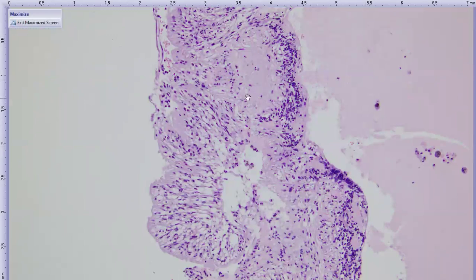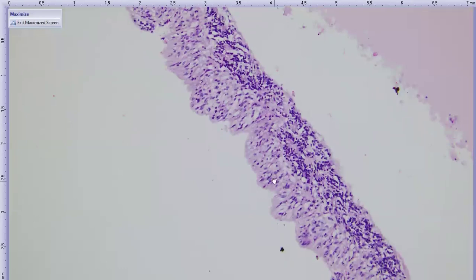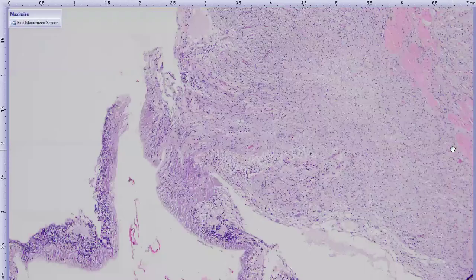But what I thought was interesting is that there's also atrophy and jumbling of the inner layers too. Maybe better to see here where it's a bit more of a flat mount. So we don't really have any retinal ganglion cells and probably not really much of an inner nuclear layer to speak of. Which is interesting to me and suggests that maybe there was some degree of glaucoma in this horse, maybe preceding the retinal detachment at the site. And I blame it on synechia and things like that in the anterior segment. So a lot of extra things for this horse, some bonuses, I guess you could say, in terms of diagnosing the ERU as the main thing.